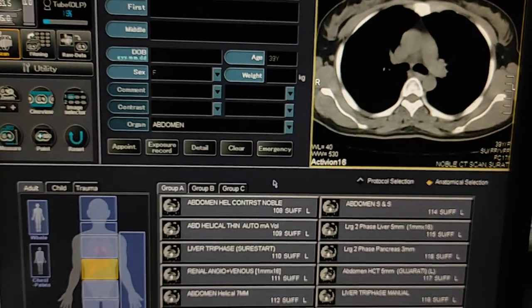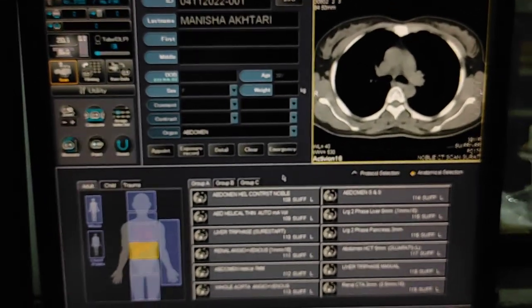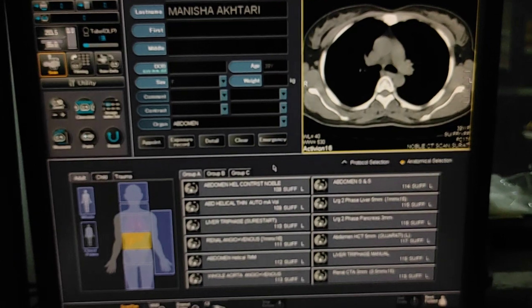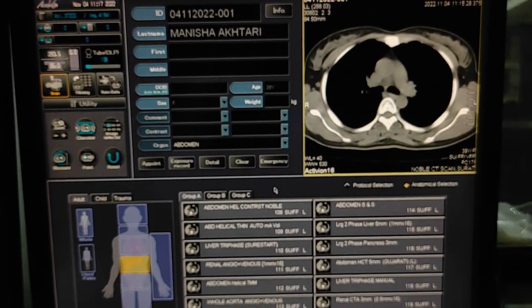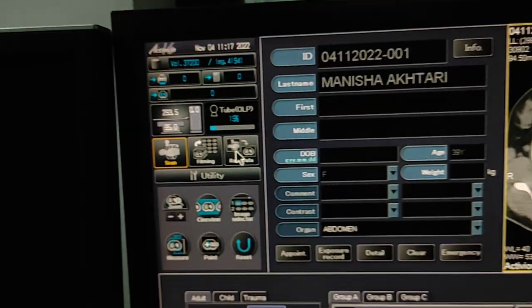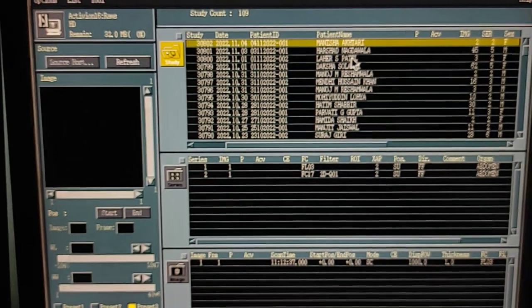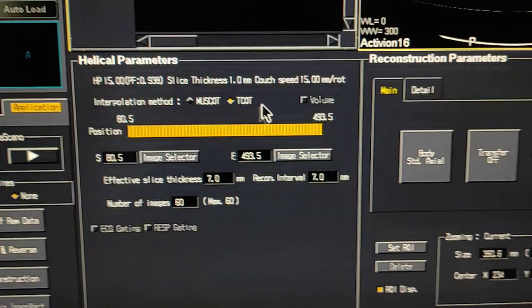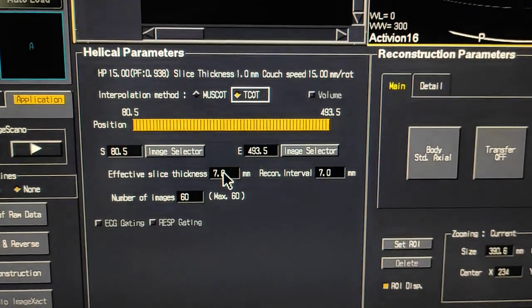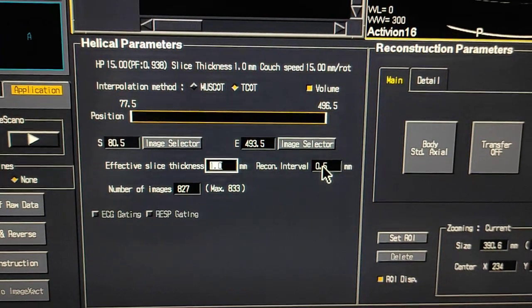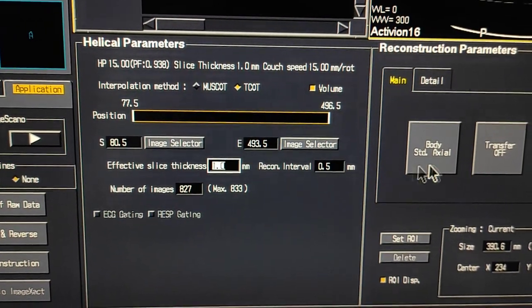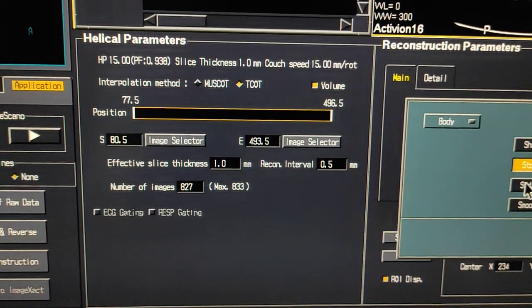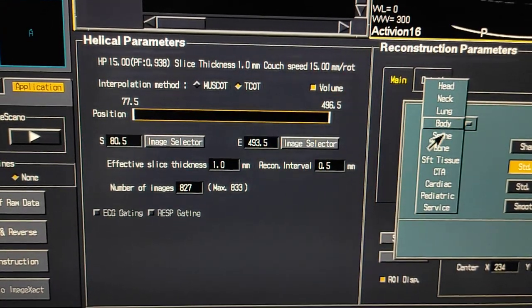Now you can ring the bell and get the patient out from the gantry. Now I will show you how to do recons for the bony window. Click on the raw data, click on the patient, select the series. Always take the scan in 1mm so that you can get a good recon. Change the thickness to 1mm. The interval of 0.5 is okay. Now select standard — I will select spine from here.